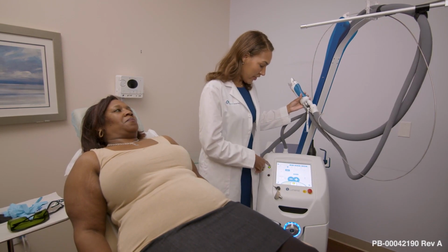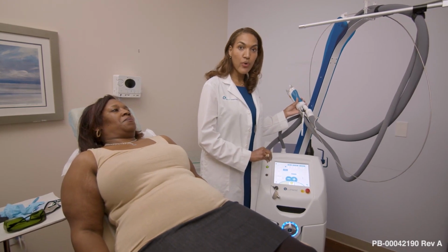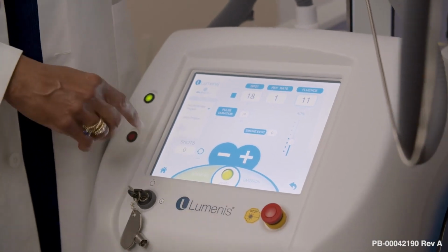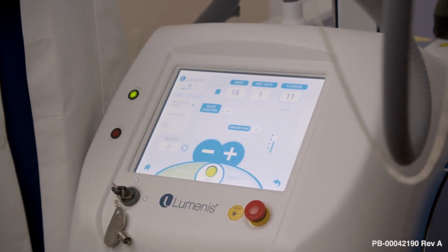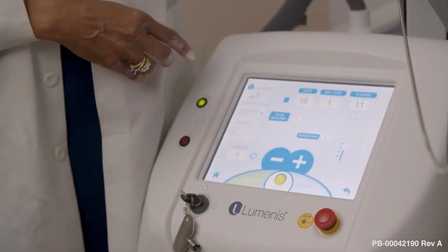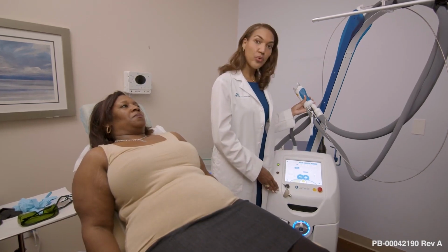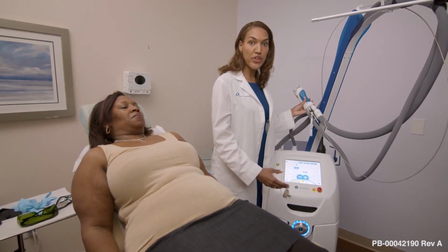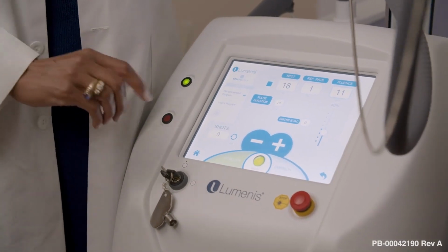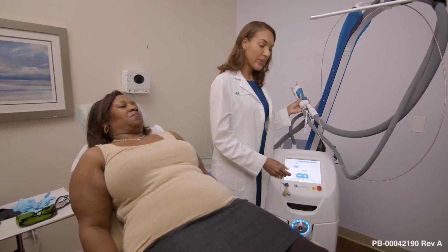So with the setting that we're using today, which is for Fitzpatrick 6 skin type, thick, dark, coarse hair in the underarms, we're going to use program 46. It walks us through it to get to this point, and then we're using the 18 millimeter spot size. I always double check that. A rep rate of 1. The fluence, which is pre-selected based on the parameters the software walks you through, is at 11, which is 40% of the range. So with each repeat treatment, you can go up. And then the pulse duration is 20 milliseconds. And then the smoke evacuator, you can set to the setting that you like. I generally like 5.